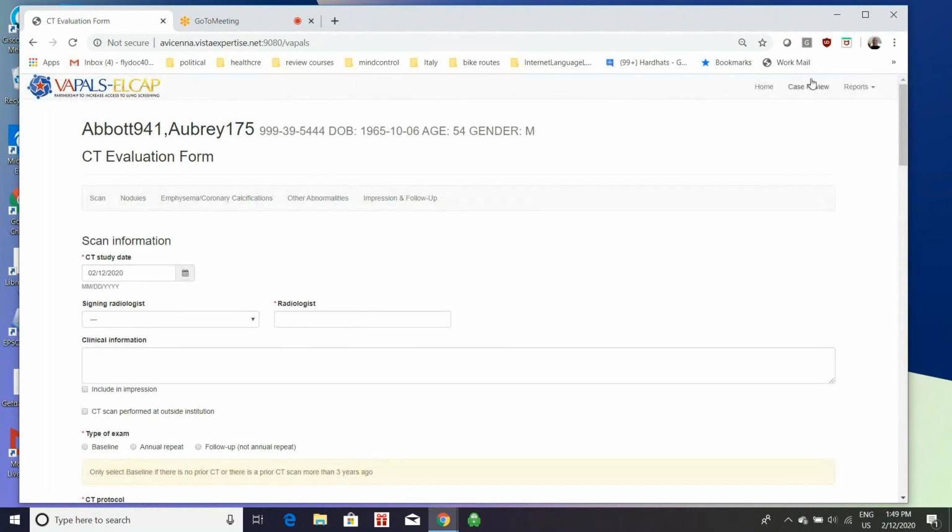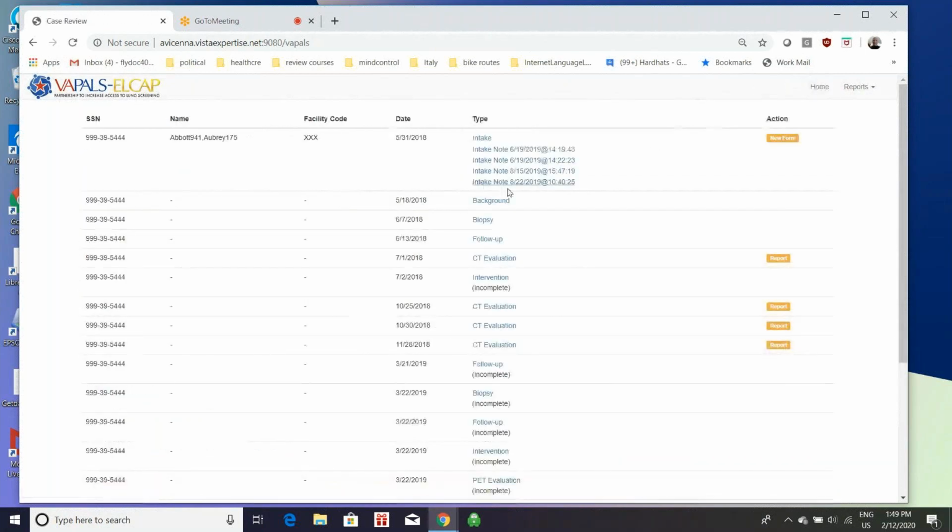So, Arden, have you had a chance to look at the copy forward at all? Yeah, it looks like it's working. Well, I guess as you just demoed it, it looked fine. Okay, cool. Great. So that's a new feature that we added within the last few weeks.